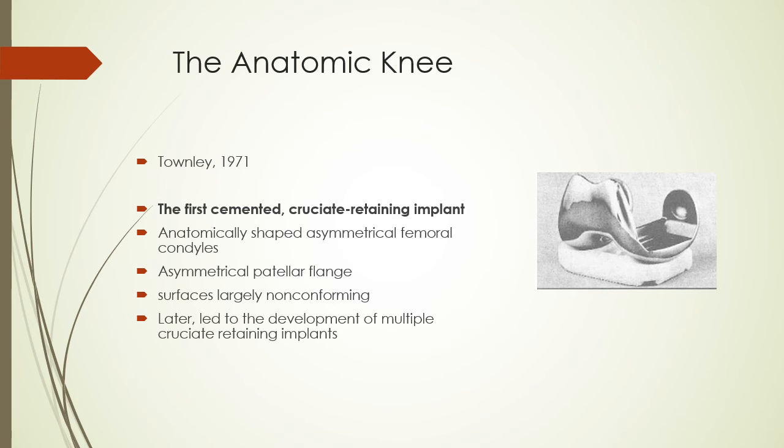As we mentioned before, for anatomic design approach, the articulation surfaces on the tibia are largely not quite conforming, to allow the soft tissue to drive the motion. And later, this design led to the development of multiple CR implants. As we can see, it's an anatomic approach design.